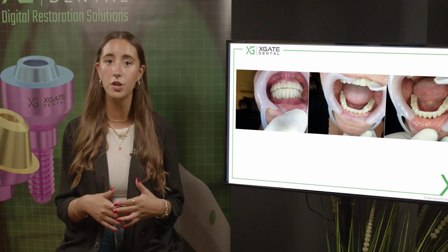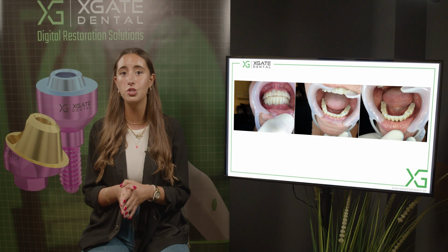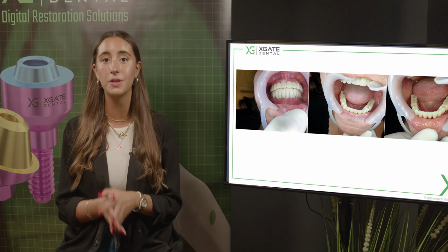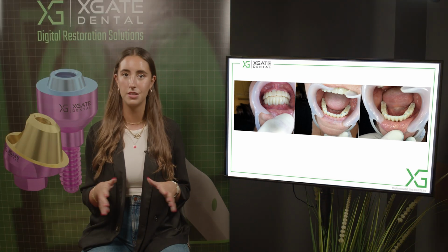A lot of contact points, which is quite good, not perfect, but the midline, all of the restoration itself, the aesthetical part, the functional part, is not bad for a provisional restoration, for the first bridge that you have after you took impressions on the implants that were immediately placed and immediately restored. It's not easy to get this type of contact.